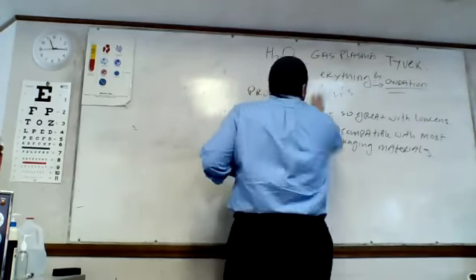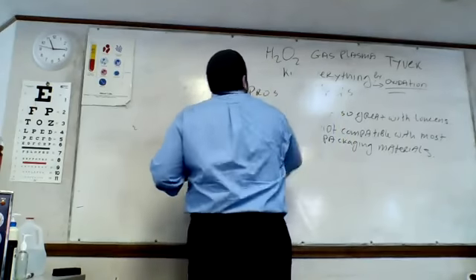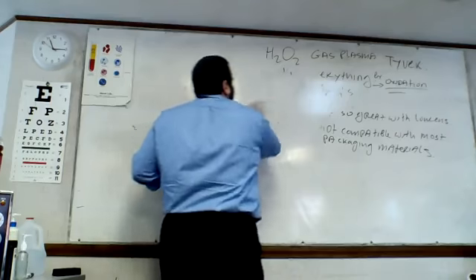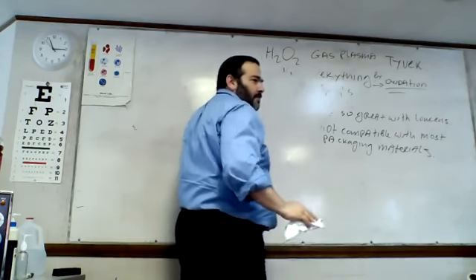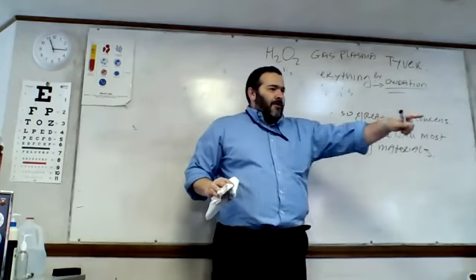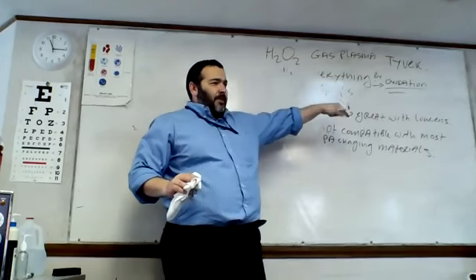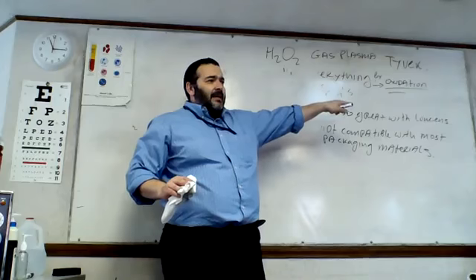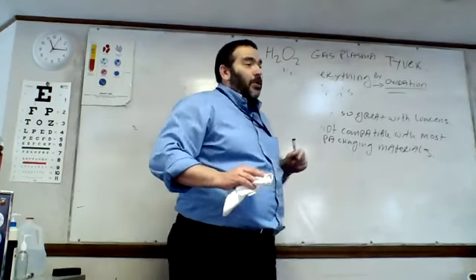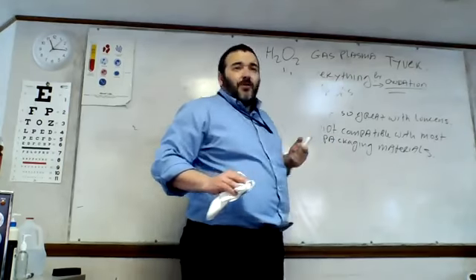And the other good thing about it is because it's done at low temperatures, there's no cooling time required, like when we do things with high temperatures, we have to cool it down. Now, remember I put a few things on the board and said we have to talk later about ethylene oxide. There's a few things about procedure for ethylene oxide that I have to discuss with you. So remind me to get back to procedure for ethylene oxide.